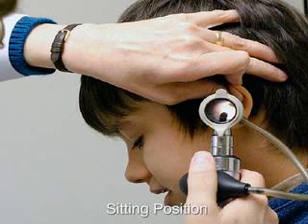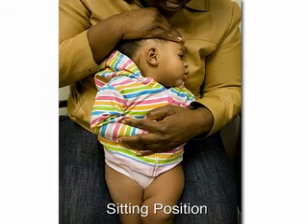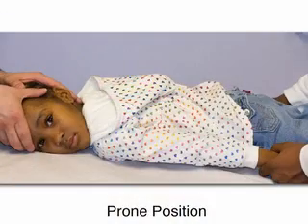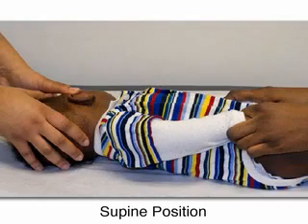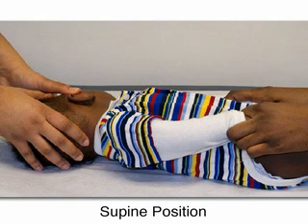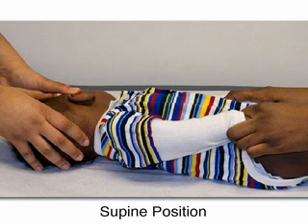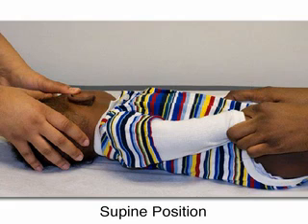Older children and cooperative younger children may be examined in the sitting position, either in their parent's lap or on the examination table. Uncooperative children are best examined while recumbent, in either prone or supine position. The head should be firmly immobilized by an assistant. A second assistant, usually the parent, braces the child's body against the examination table, and one of the assistants must also firmly hold the child's hands.